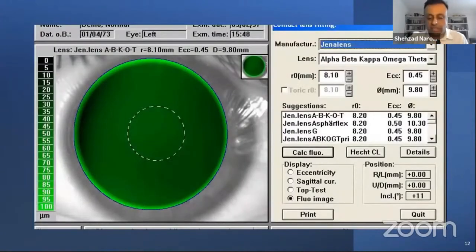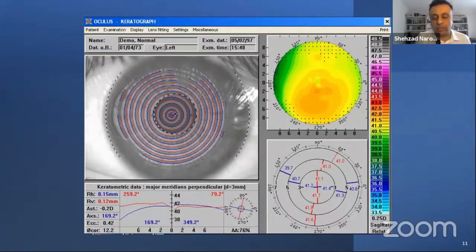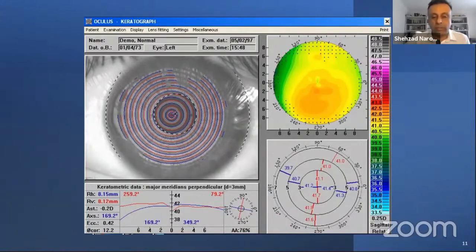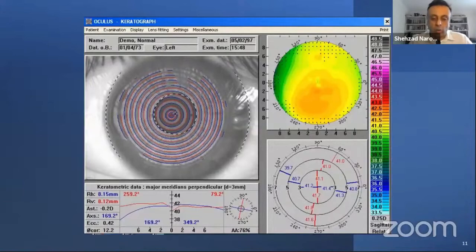It's worth noting that your keratometer reads only the steepest and flattest meridian, whereas the corneal topographer reads thousands of corneal K values — anywhere from about 7,000 to up to 20,000 data points. On a real topography image you can hover your cursor at any point and read the corneal K value there. It's a very detailed map of the entire corneal curvature.